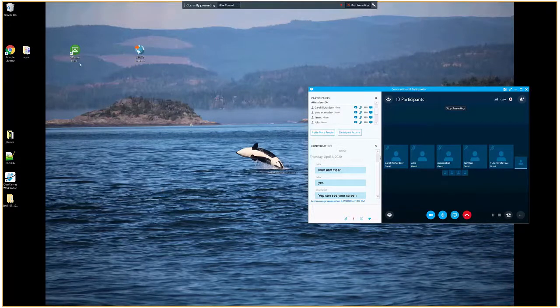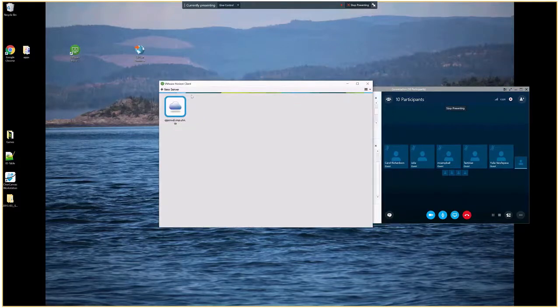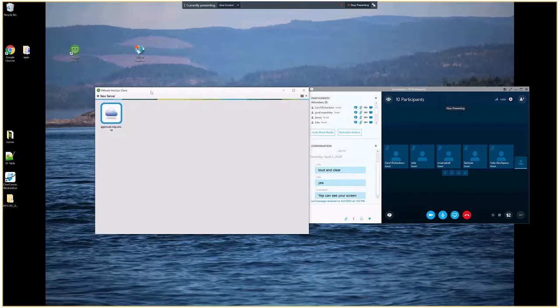So from a QC perspective, what do we have to do at QIPCM with those images? I'm actually going to show you how we log into the remote desktop, because it's the only way I can get to it since I'm working remotely. This is the same way your study investigator or any PI would log into QIPCM. This VMware Horizon client is the application we use to do that.